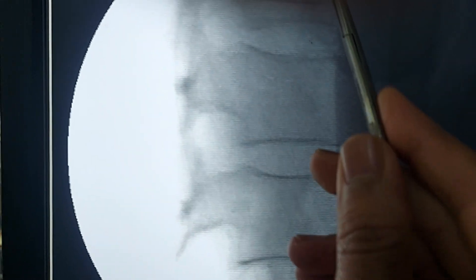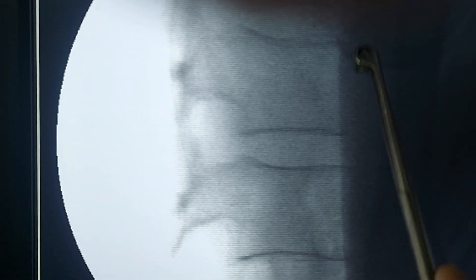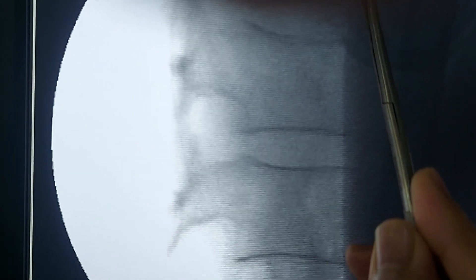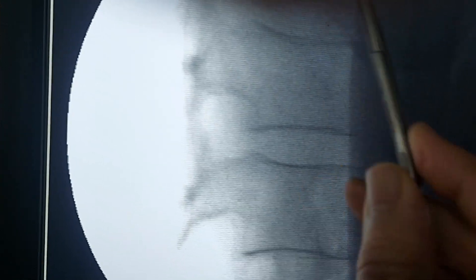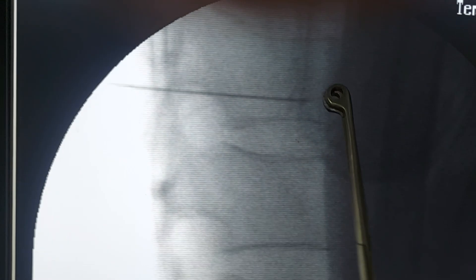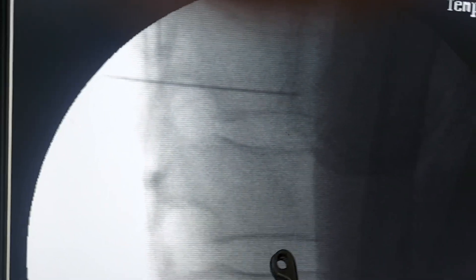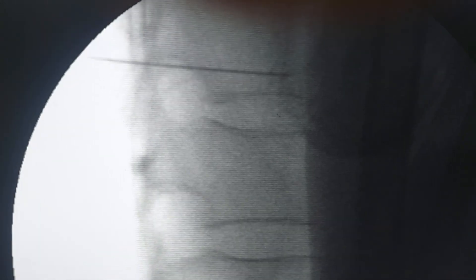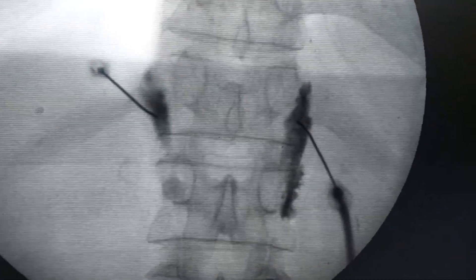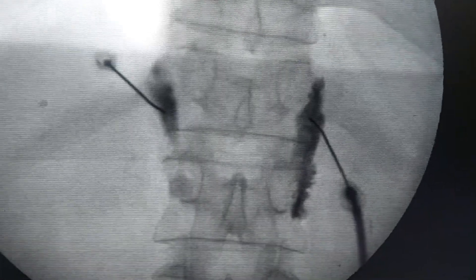In the lateral view, your dye should spread between the posterior two-thirds and anterior one-third of the vertebral body. We had a nice dye spread but unfortunately couldn't capture the lateral image. In the AP view you can see a good dye spread, and we can now give the drug or perform radiofrequency ablation.